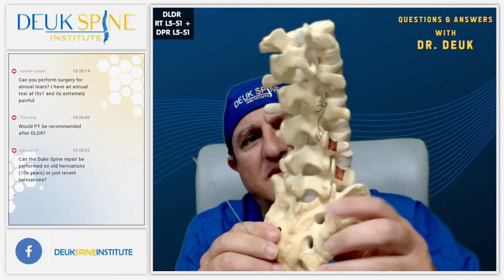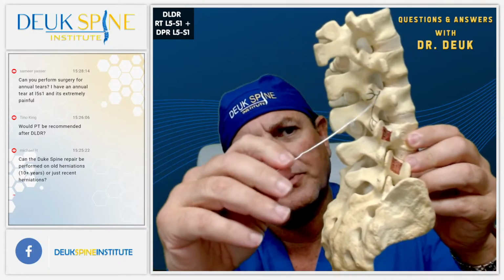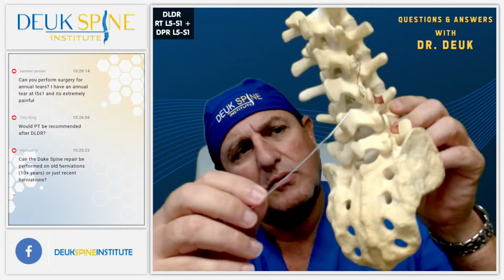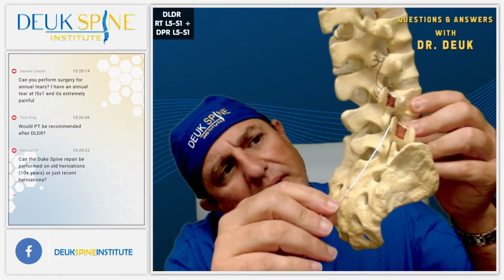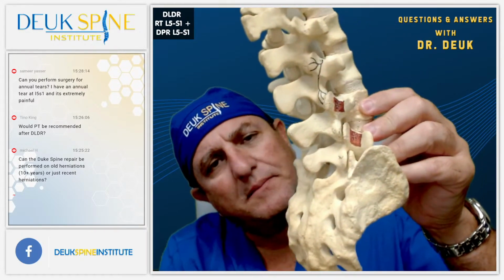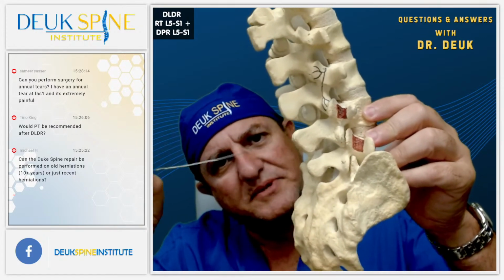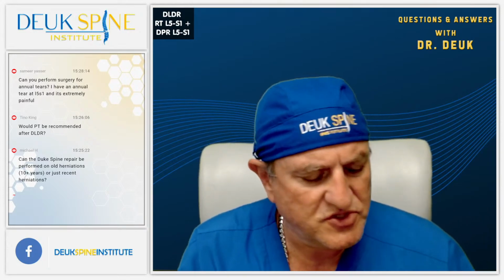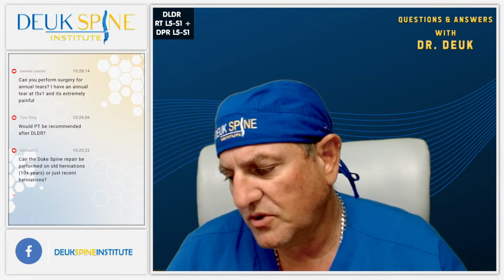Well, what if the nerve isn't there? What if the nerve is off to the side a little bit? You can see these nerves run along the bones. Well, with the Deuk plasma rhizotomy, that's what we're doing. You guys see that big patch of red right there? We get a much bigger burn area. That's because we hop and sweep, and we have a more powerful device to burn the nerve. So it's more effective.